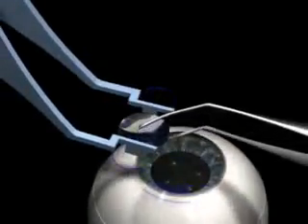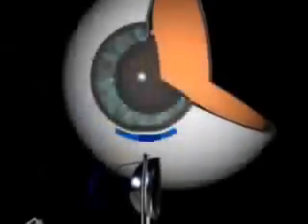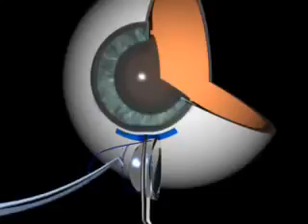IOL folding. The IOL is folded before implantation. This allows implantation through a small incision. IOL implantation. The folded IOL is inserted through the incision.